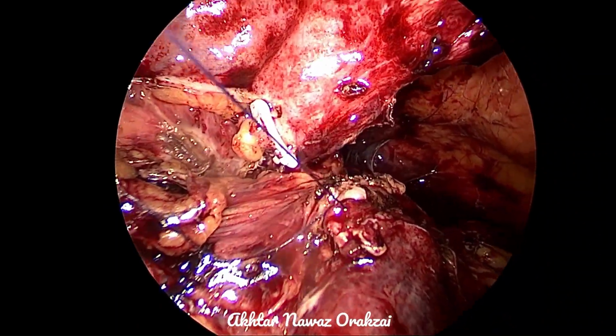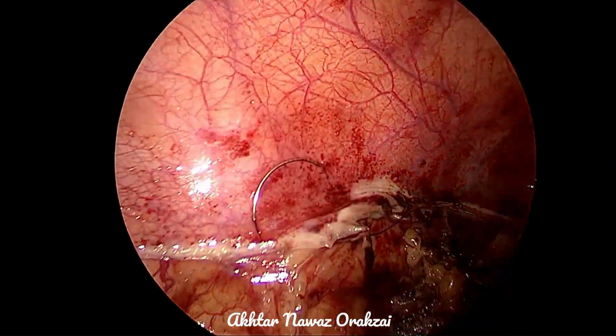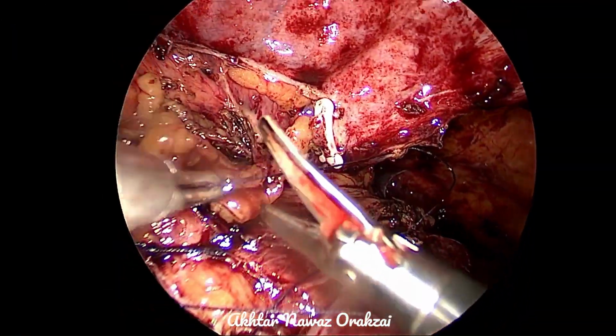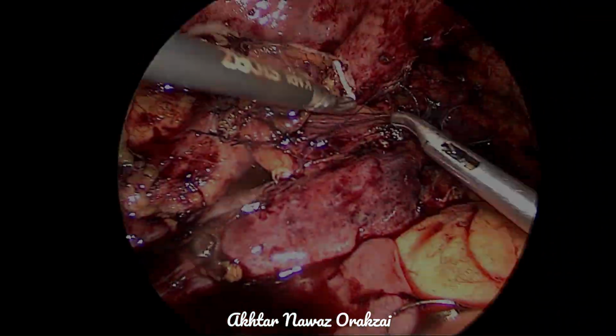And after that, one or two stitches can be taken in the perivesical tissue or the detrusor muscle. Take the needle out under vision.